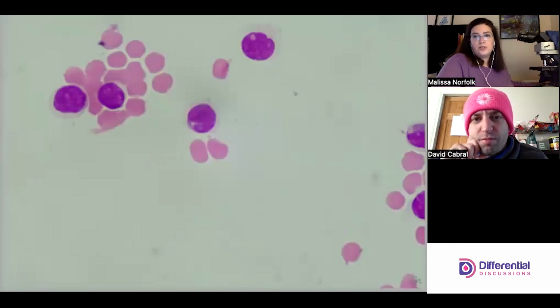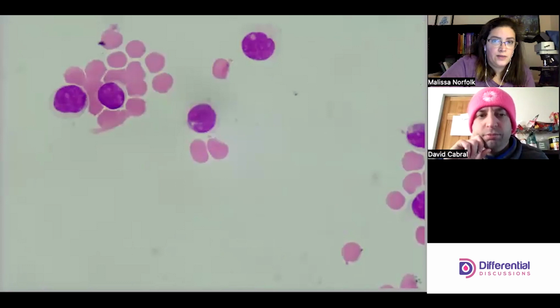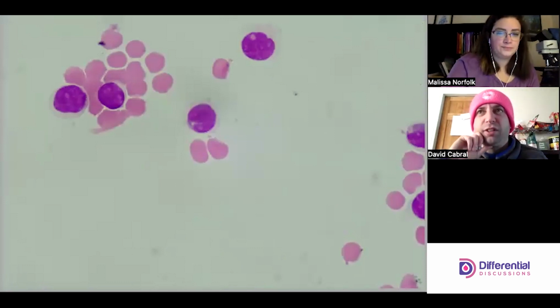Well, I don't think there's too much else in here. I think it really is those big balls of cells. I think that is probably the major finding on here. And then trying to compare those single cells that are not quite right looking to, are they mesothelial cells? Yep, and that's a tough call.